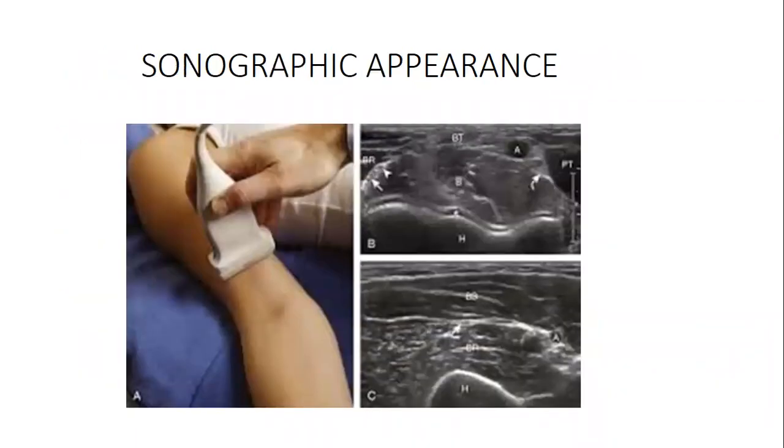So this is what I'm trying to explain. I should also mention that sometimes you can start in the mid joint, and then you go slightly distal to proximal, and you can see some specific structures. You have to forgive me, I think my images are not very clear, but when you look at this, this is the brachial artery in an elbow joint.